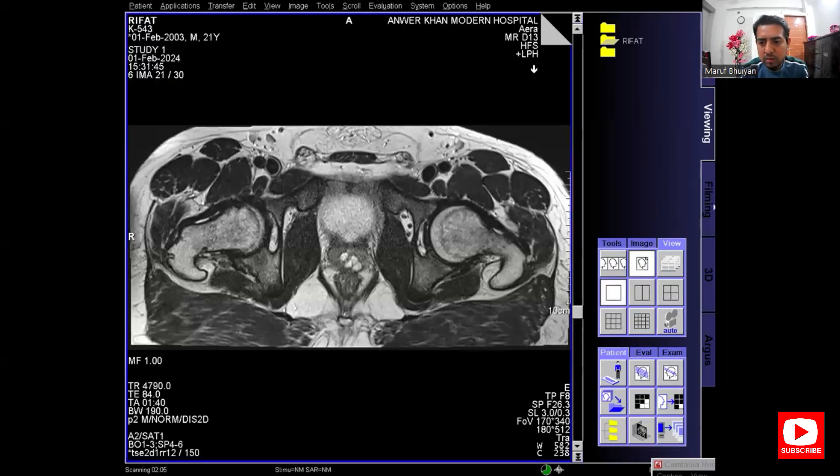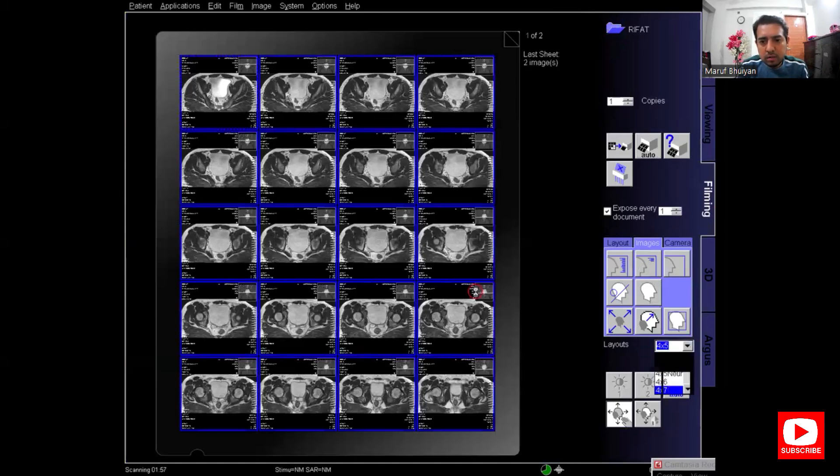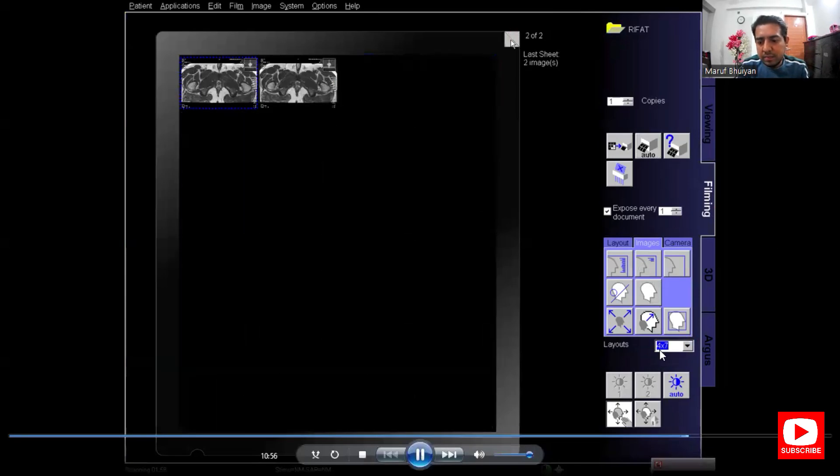Select the series and send it to filming. Go to filming, select the folder, and change the filming layout.